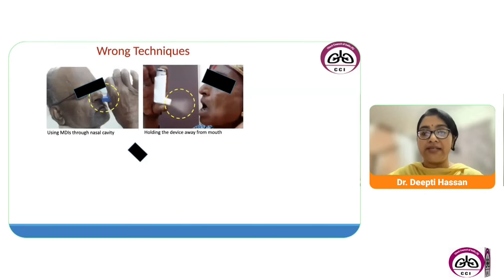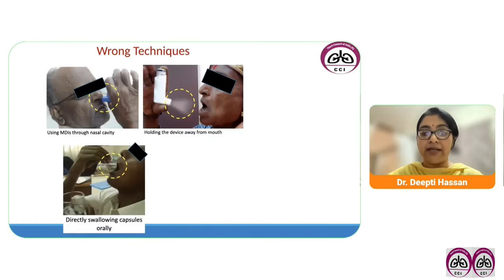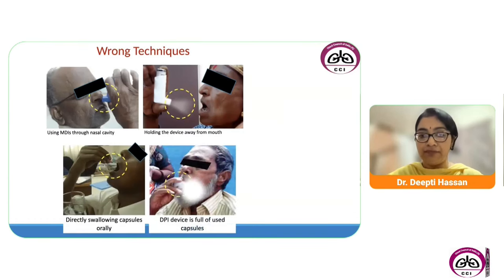Here, they are holding the device away from the mouth, so a lot of drug is lost already. Here, they are directly swallowing the capsules orally, which is of no use. And here the DPI device is full of used capsules.